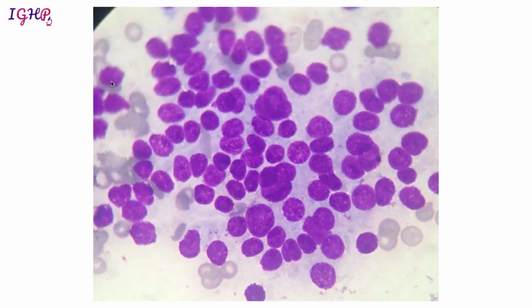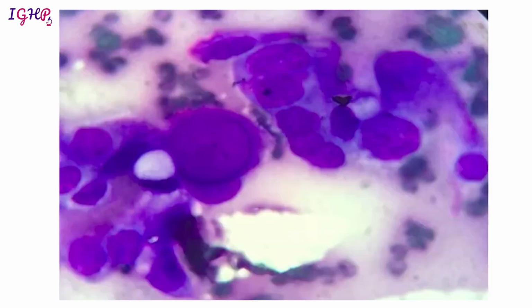So this is again category 4, in which it is not malignant but it is some specific type of pancreatic lesion which is a neuroendocrine tumor. So this is a category 4 lesion.